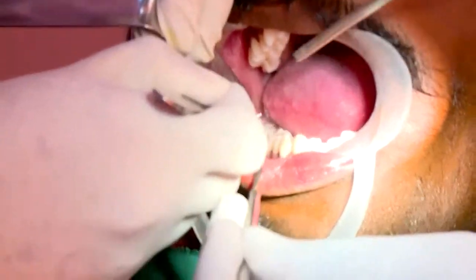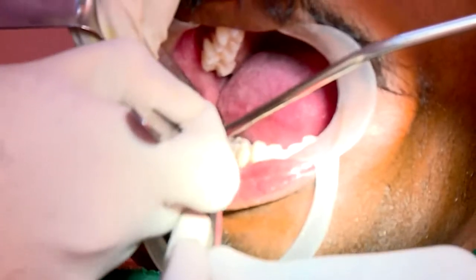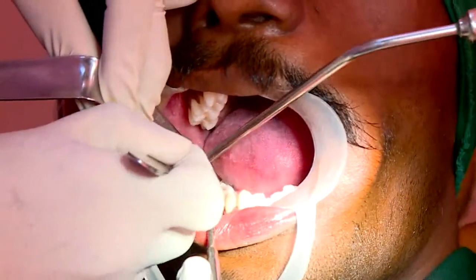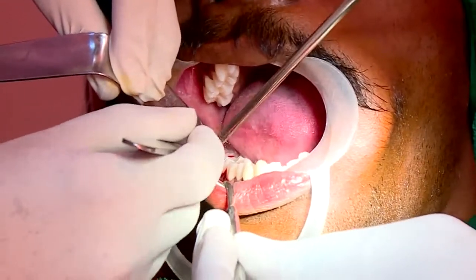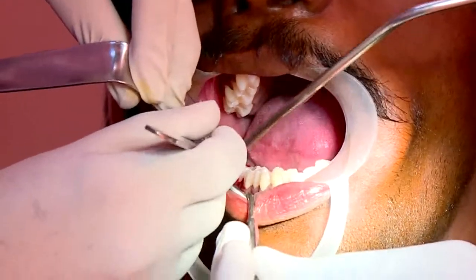So he is using the knife and pulling it towards him. So there is a chance for him to slip. Doing it the opposite way, you slip, you go down and touch some other structure.